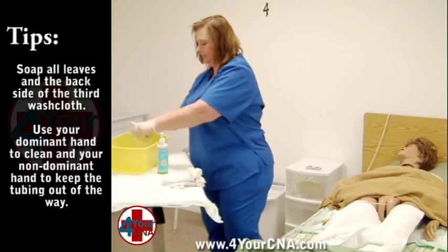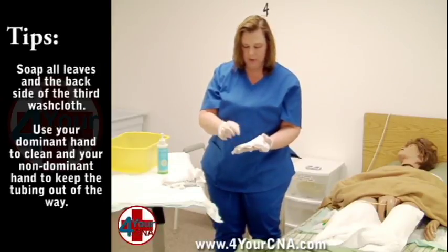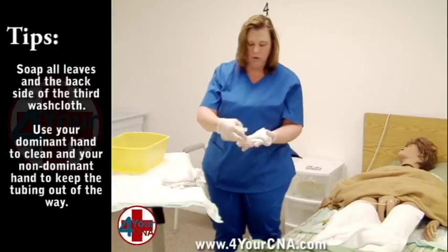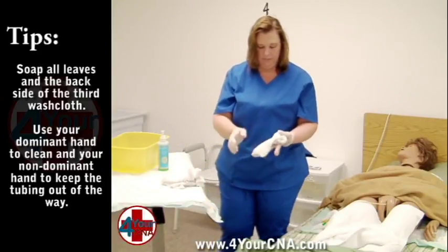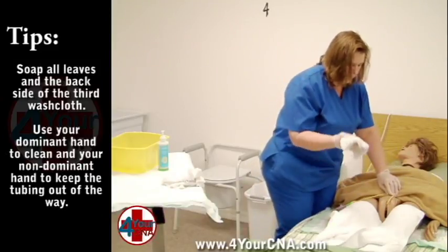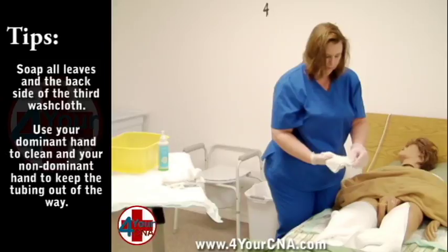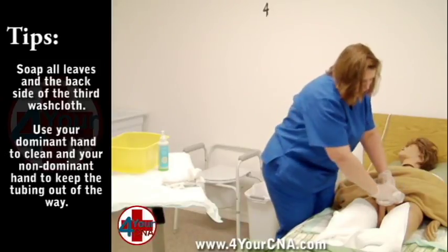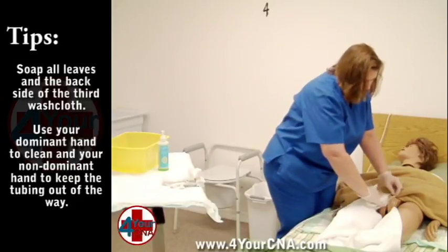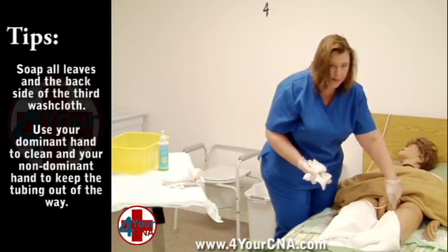Ring the third washcloth out thoroughly. Smooth the washcloth and ensure that it is folded in fourths. You will hold the washcloth the same way and spray soap on all four corners and the back of the fourth corner. Position the washcloth in your dominant hand. Your non-dominant hand will rest at the top of the patient's perineal area and hold the catheter out of the way while you use your fingers to spread the labia apart. Clean with one stroke straight down, then pull the washcloth away. Fold that leaf over. Using the second leaf, clean down one side of the labia from top to bottom and pull the washcloth away. Fold that leaf over. Repeat on the other side of the labia and fold that corner down. The fourth corner will clean the skin fold between the leg and the groin, and the back of the washcloth is used for the other skin fold.